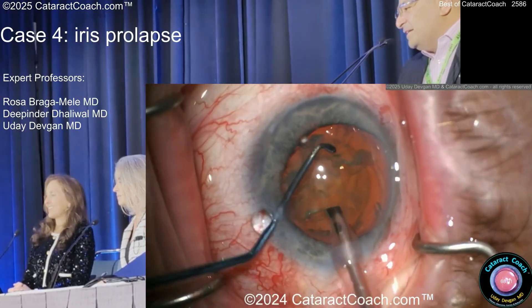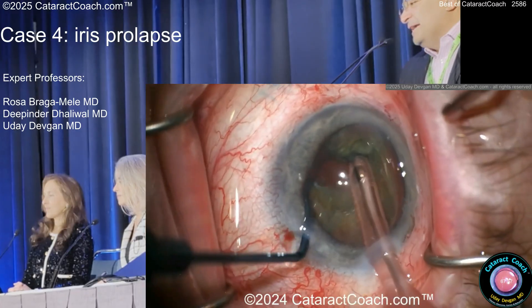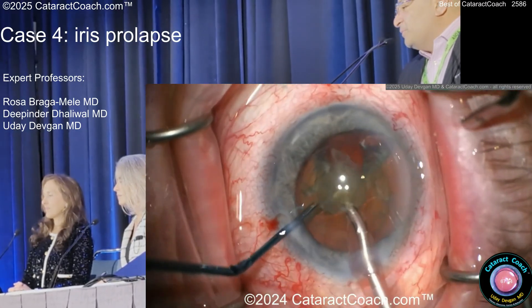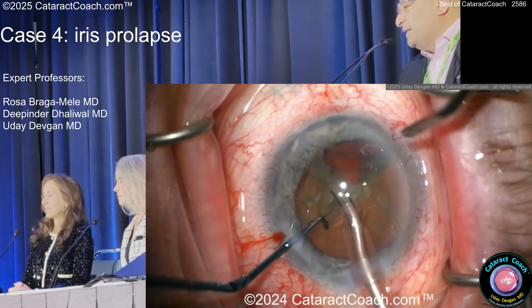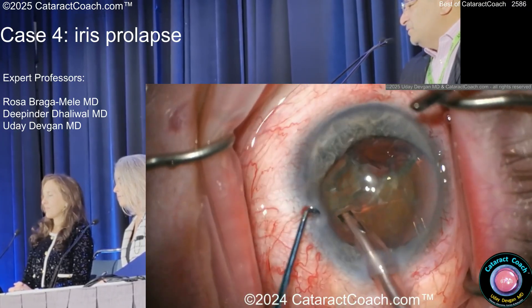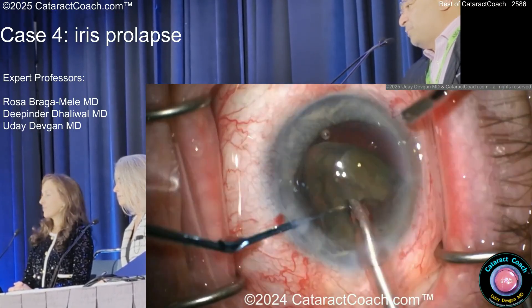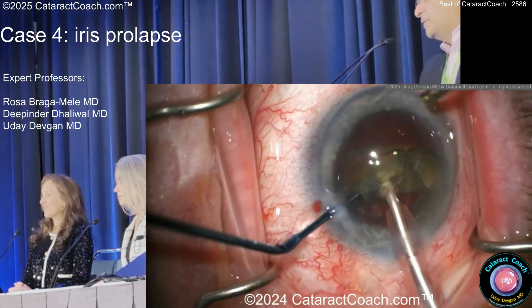Here we go, let's see the technique. Looks like a pretty good horizontal chop. So far, so good. I don't see any issue with the iris at this point. Now, obviously, with the tube in the eye, you have to be concerned with the fluidic imbalance — too much outflow. You're going to get flow out the tube, leakage from the incision, plus what you're aspirating on the tip.